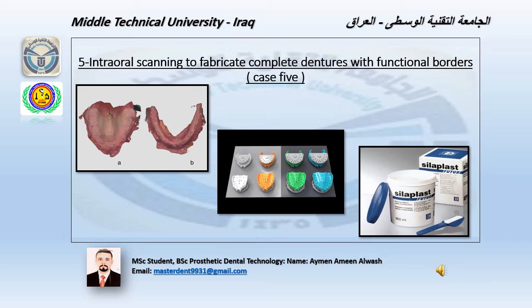Number 5. Intraoral scanning to fabricate complete denture with functional border. Case 5. In this technique, we will use intraoral scanning to record the edentulous upper and lower jaw.